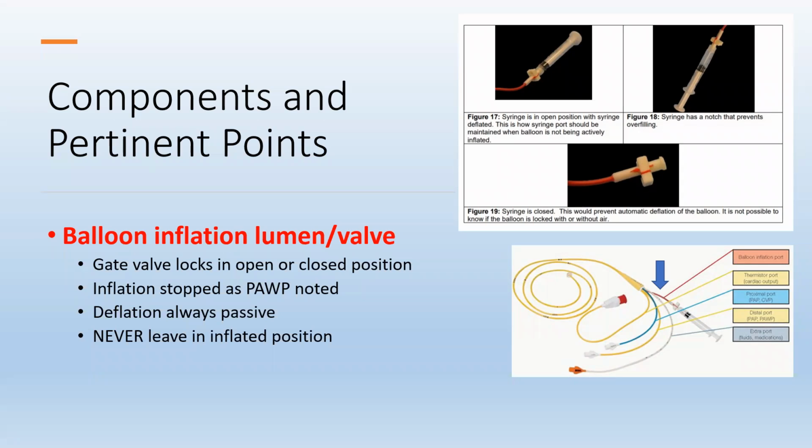And the second reason is also to float the catheter into position and therefore allow measurement of the pulmonary artery occlusion pressure. So what is this pulmonary artery occlusion pressure, also known as a pulmonary artery wedge pressure?